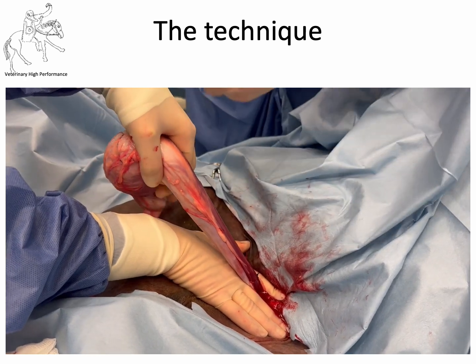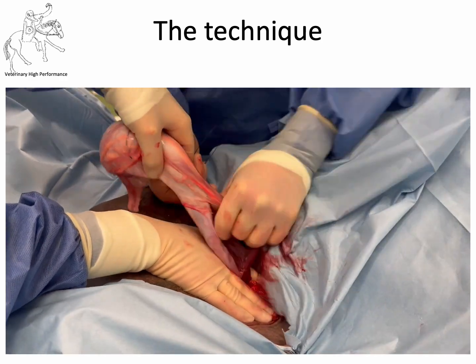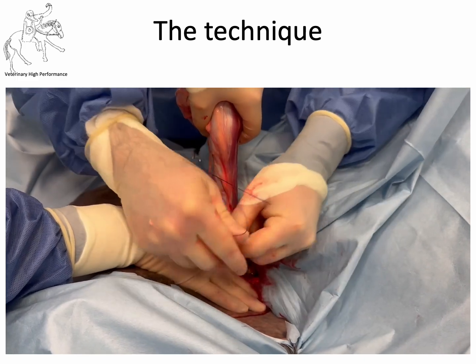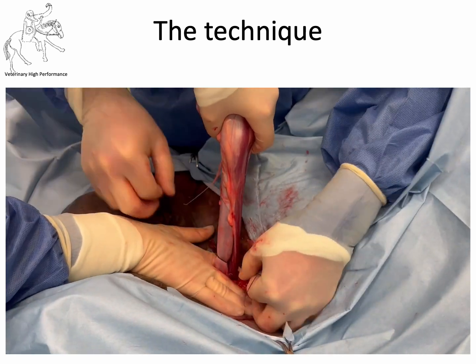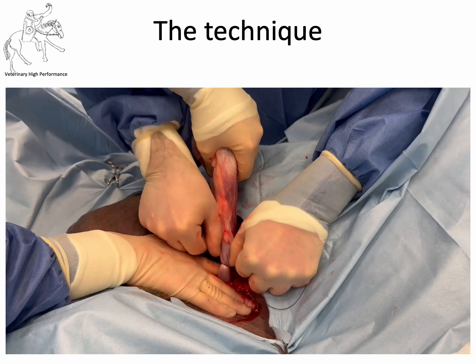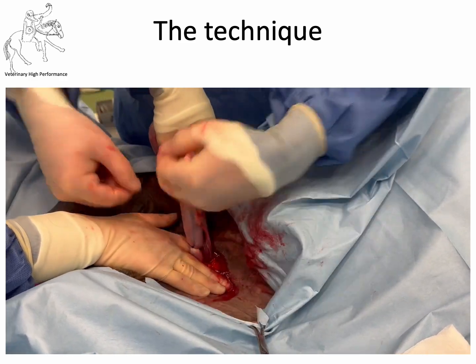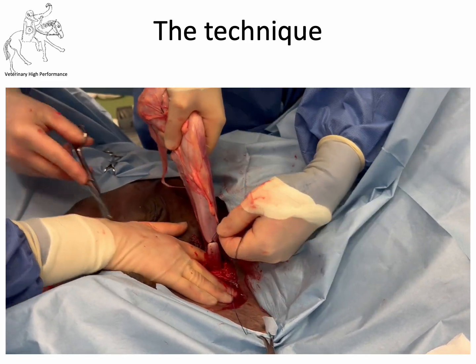We're then going to apply a similar ligature — an important encircling ligature around the spermatic cord itself, placed in the same way. Two throws on this surgeon's knot at the start, then pulled into position — get those thumbs right in there at the base of the knot and really jerk it into position. Take some tension off; your assistant can help. Make sure you've really seated that ligature extremely well. It's an encircling ligature, not a transfixation ligature — with a transfixation ligature there's greater risk the suture stays with the cord while vessels move elsewhere. Then cut that.